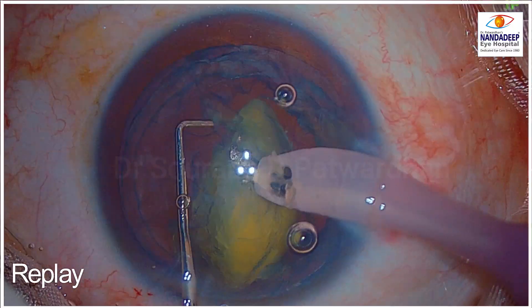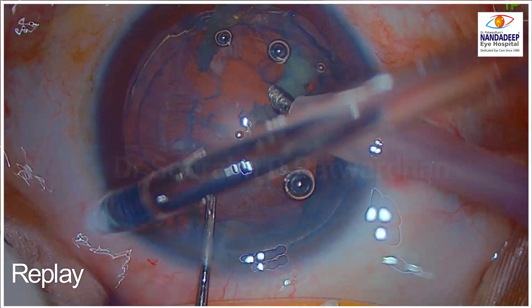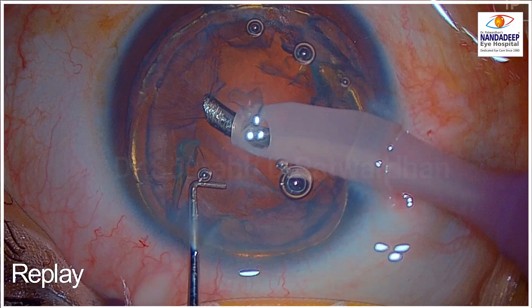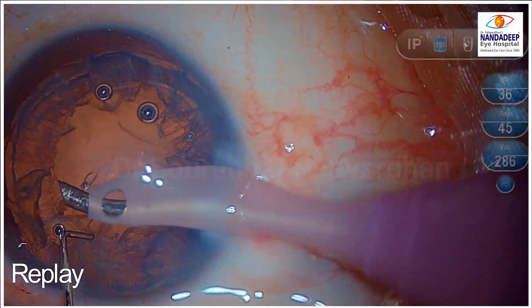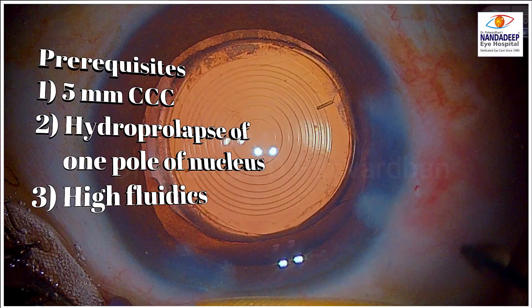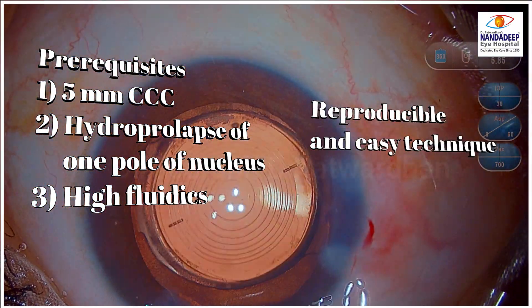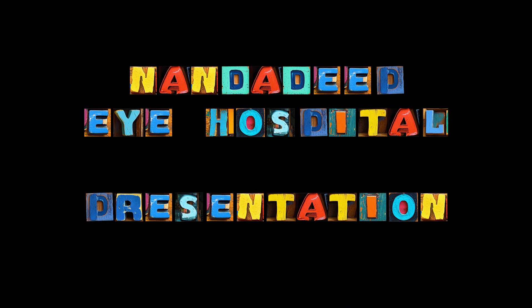It's not a very soft cataract as you can see, but still I could easily do FACO aspiration here using little energy. The CDE use was hardly around six, which is very small. So the prerequisites are: 5mm CCC, hydro prolapse of one pole of the nucleus, and high fluidics. It's a very reproducible and safe technique. I think next time you go into the OR, do try it. Thank you.